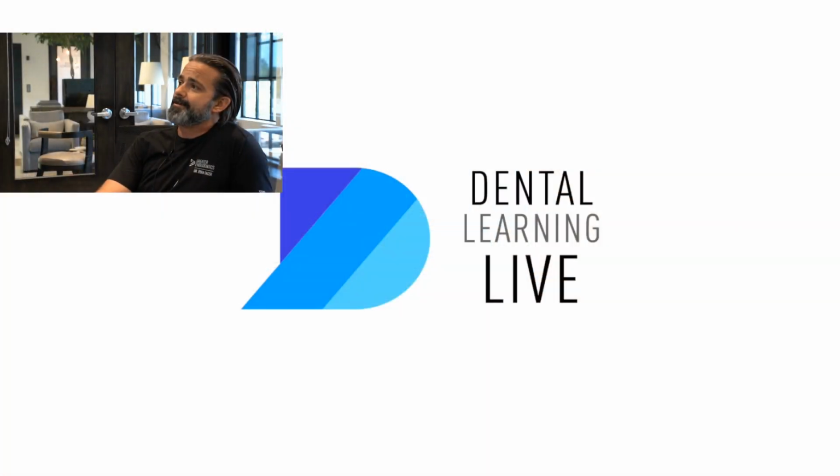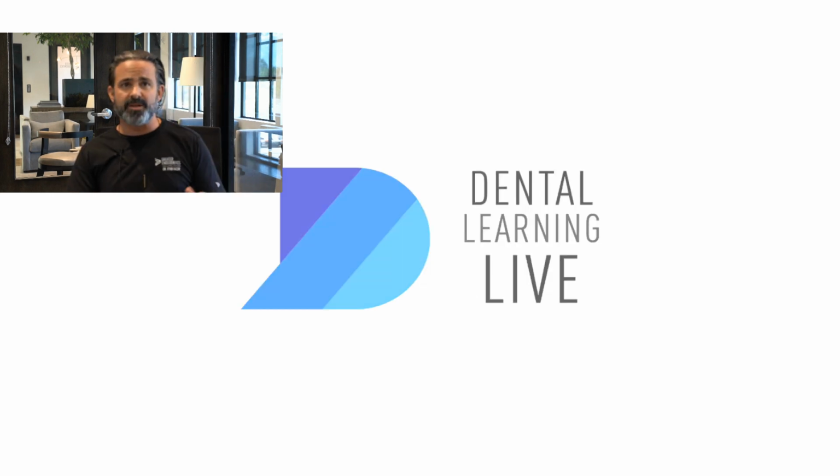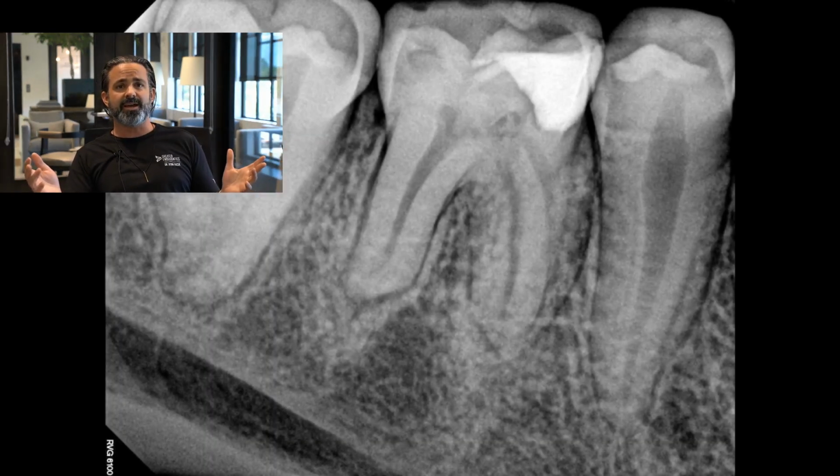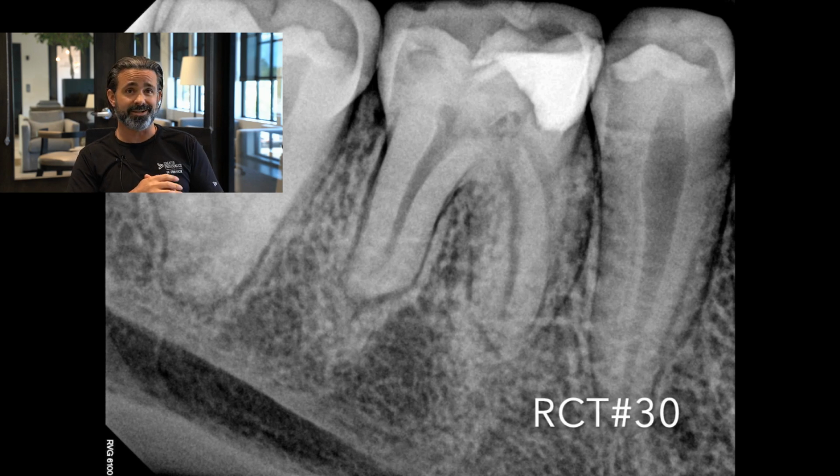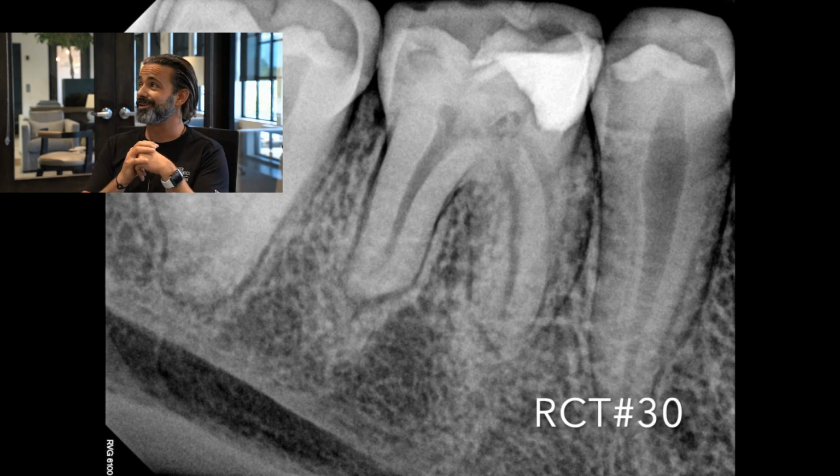Patient management issues is the highlight, and we're going to go through how and why GentleWave was useful in this case, which is why I wanted to show you all about it. All right, let's give this a go. We'll give this a start. And anybody who's watching live, I have Vicky over here ready to tell me what's going on. So you talk to me, folks out there in the endo world.